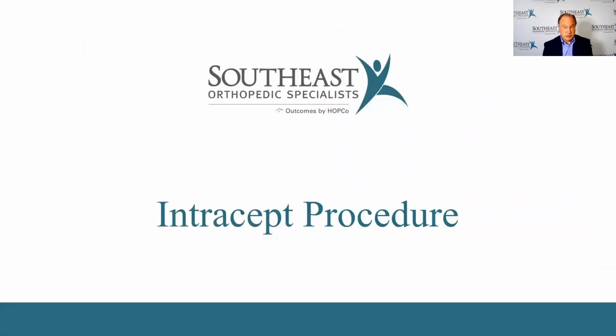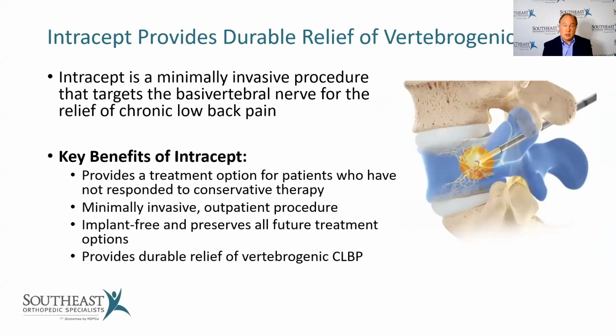So the Intracept procedure itself is for the treatment of chronic low back pain associated with Modic end plate changes. What it is, and it's shown again here in schematic form, is a minimally invasive procedure. The target is the nerve itself that transmits pain. Through a radiofrequency ablation procedure, that nerve is deadened so it no longer transmits pain.